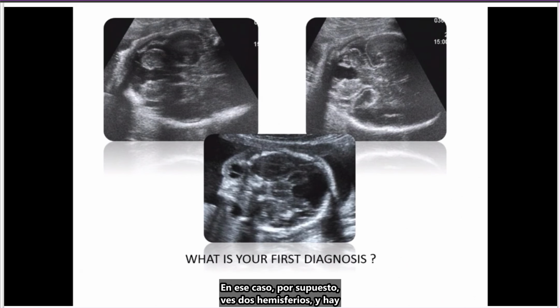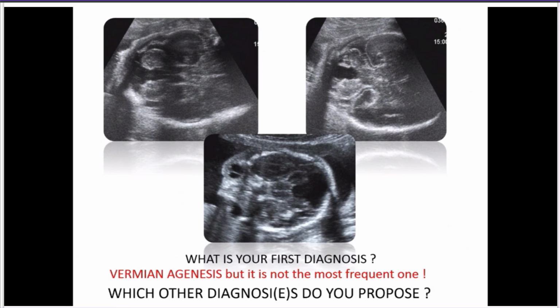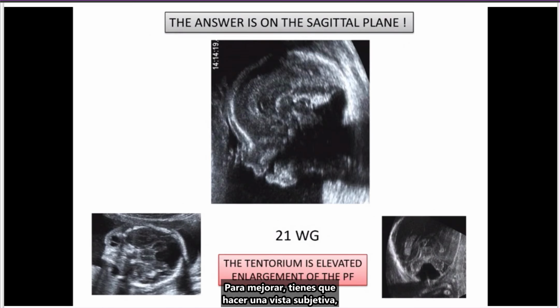In that case, of course, you see the two hemispheres, and there is something missing in the center, which is a vermis. So your first diagnosis can be vermis agenesis, but it's not very frequent. It's very rare. So what is your other diagnosis? To improve, you have to do a sagittal view, and the answer is on the sagittal view.